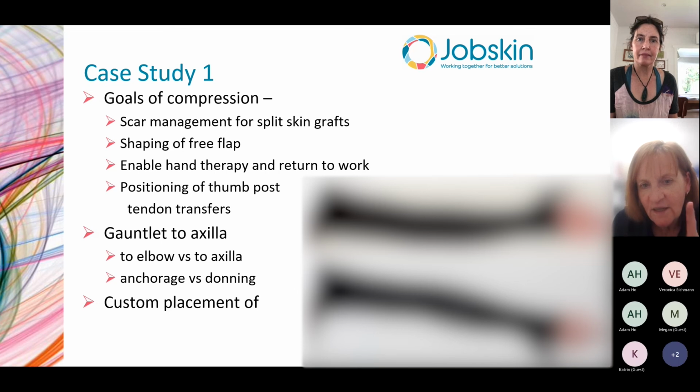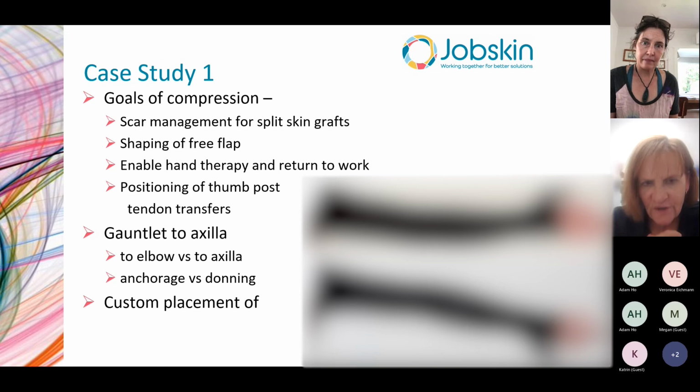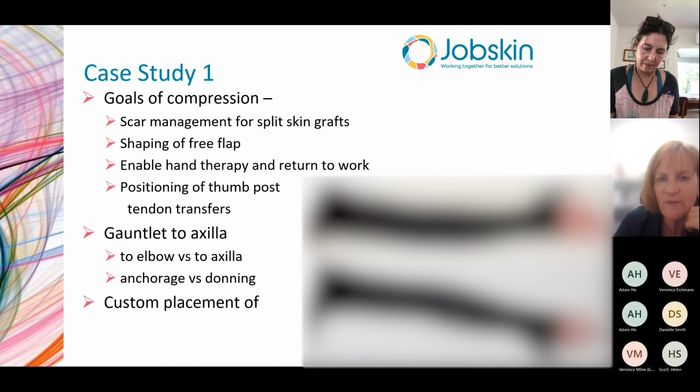The one thing I would say to highlight there is that the zip goes from just the back of the hand to the elbow, and so it's not a full length zip. You don't always have to take a zip up to the top of a garment. It can be much easier to put on when it's inserted into the garment.